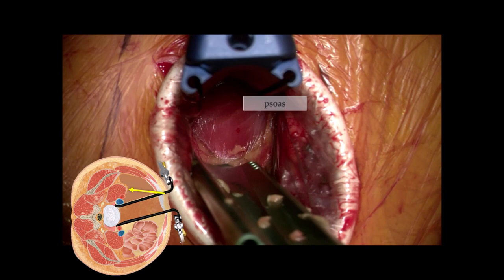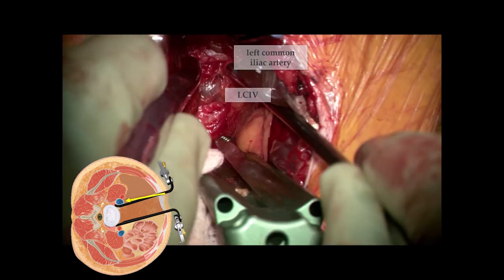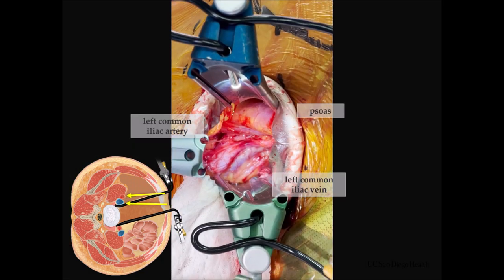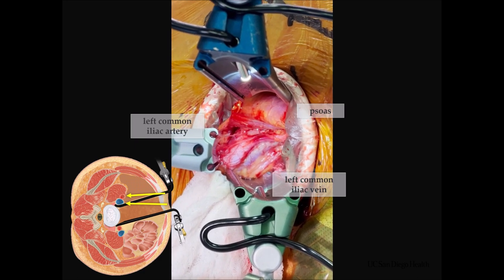The retroperitoneal fat is a key landmark — it's swept downward and anteriorly so you can reach the next anatomic landmark: the psoas muscle. The psoas tells you you're heading in the right direction, and you want all of that retroperitoneal fat and peritoneum swept in front of you. When you see the psoas, going just medial will reveal the left common iliac artery — just like the carotid when doing an ACDF, it is a waypoint. Once you see the common iliac artery, you'll see the vein just medial to that.